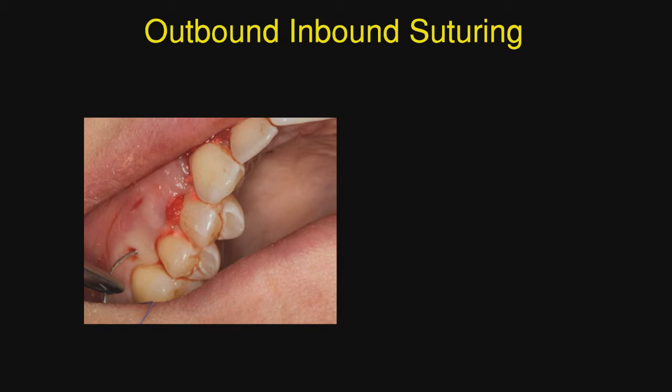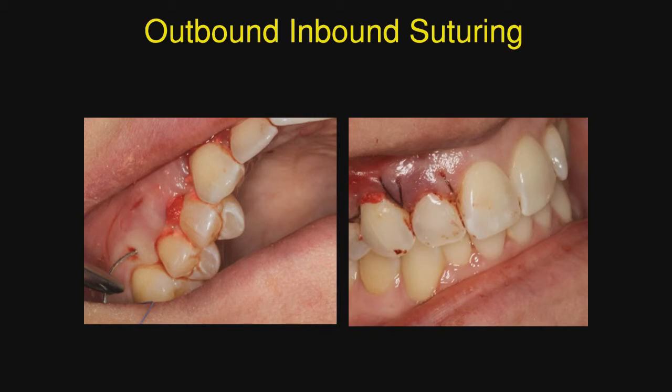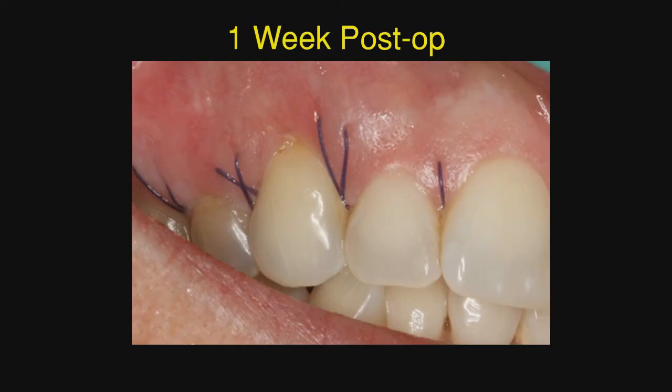We've talked many times about the outbound inbound suturing technique, so here we're beginning to do that, and now that is complete. You will notice that we did not completely cover some of the colla tape strip. I was very concerned with this, but let's see how that turned out.